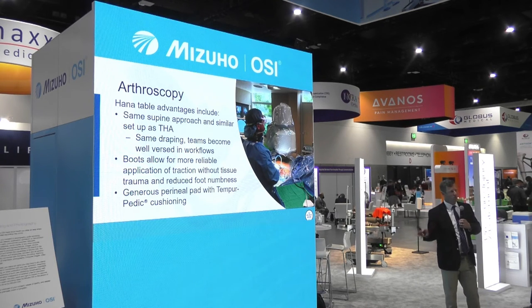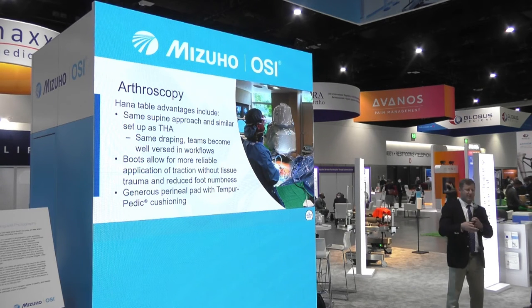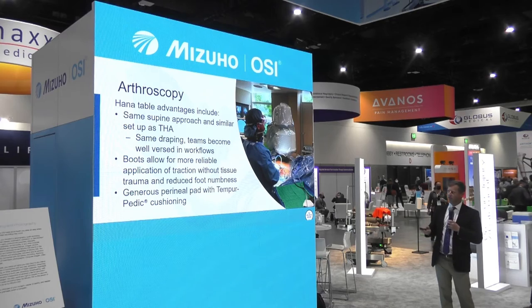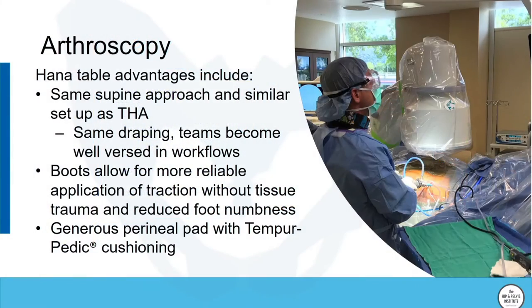So now they don't have to worry about whether he is going to use this setup or that setup. It's always the same. It standardizes that. The boots allow for reliable application of traction without tissue trauma and reduce foot numbness. The newer generation boots have been much more advanced over prior generations. We're finding much less concern related to foot numbness or problems with the boots afterwards. And we have generous perineal pads for the hip arthroscopist.